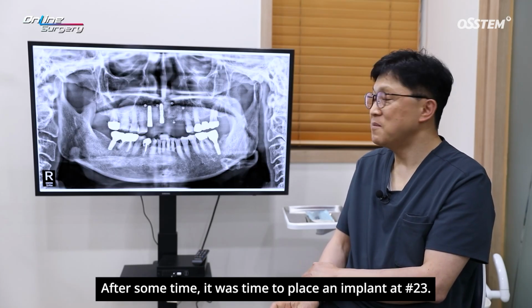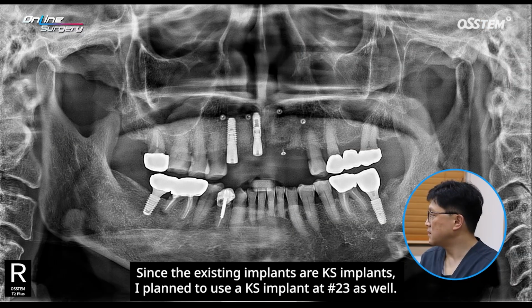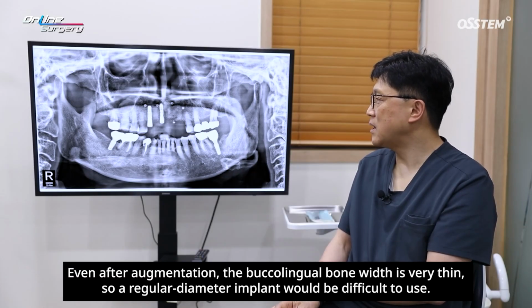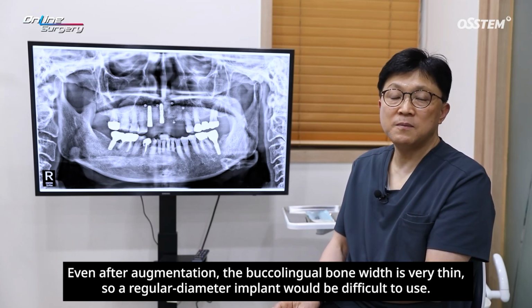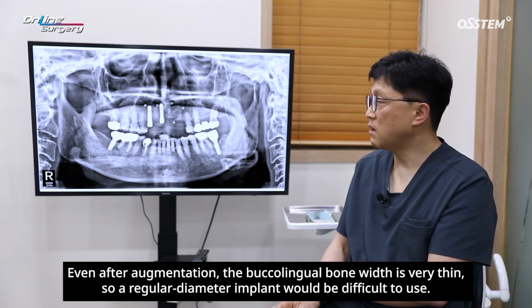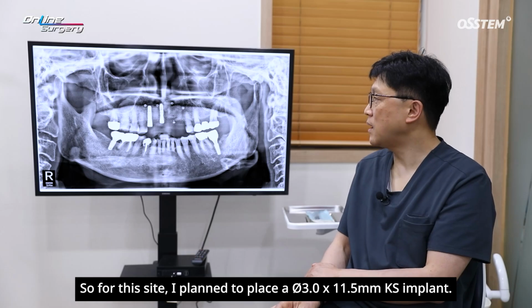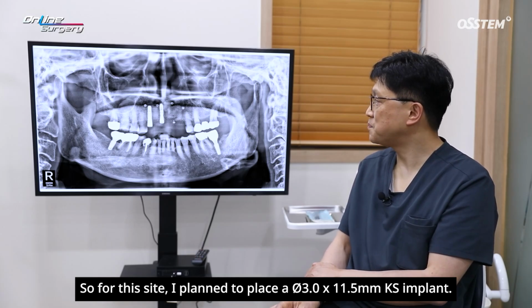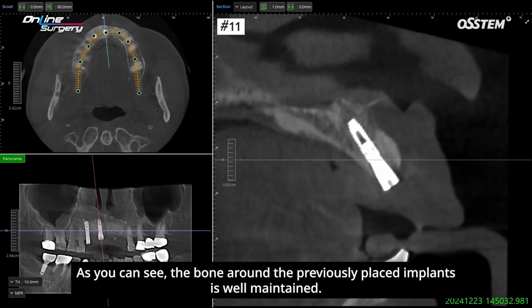After some time, it was time to place an implant at number 23. Since the existing implants are KS implants, I plan to use a KS implant at number 23 as well. Even after augmentation, the buccolingual bone width is very thin, so a regular diameter implant would be difficult to use. So for this site, I plan to place a 3.0 by 11.5 millimeter KS implant. As you can see, the bone around the previously placed implants is well maintained.